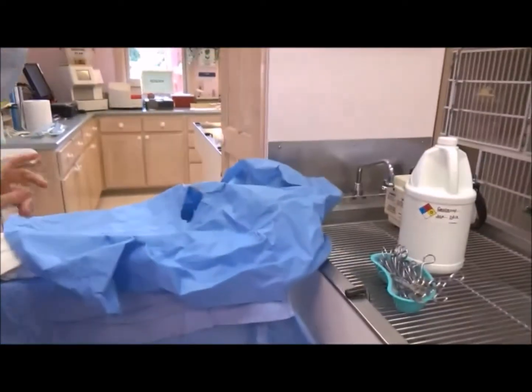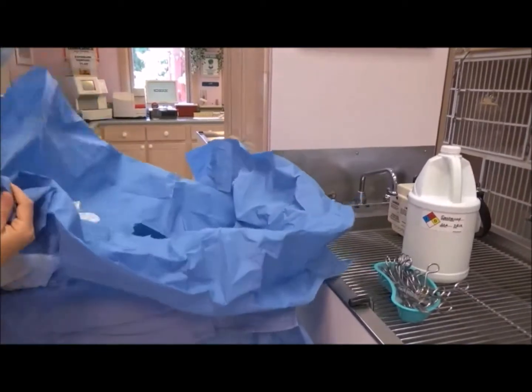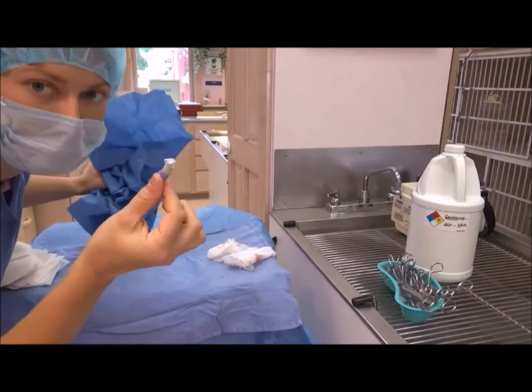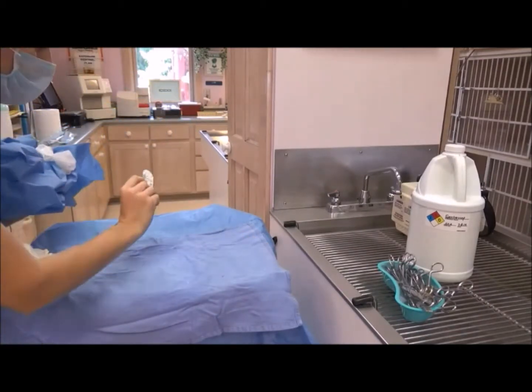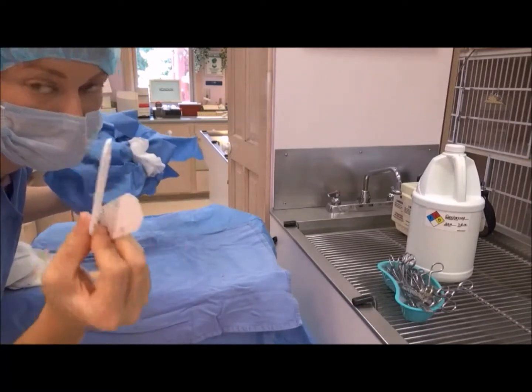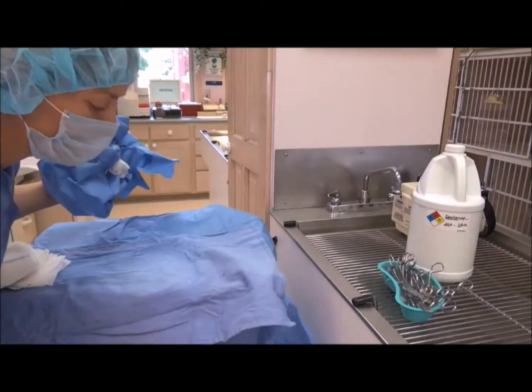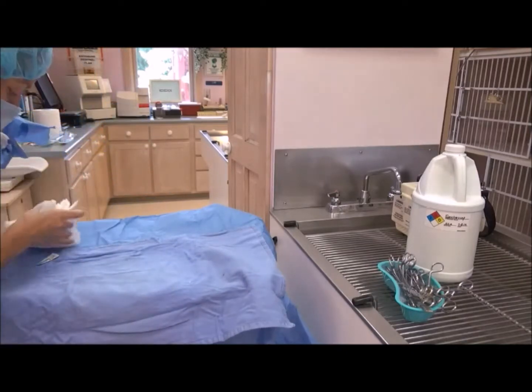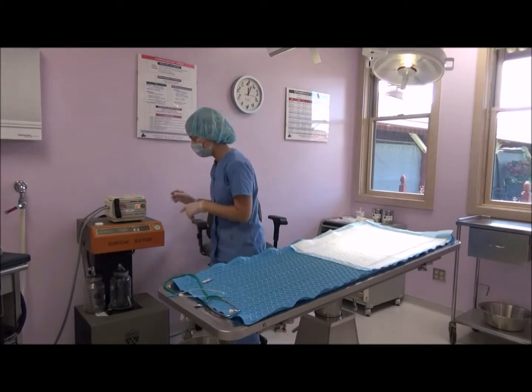Back to the pack here. For our drapes, we also use a disposable drape, so I'll go ahead and dispose of this. And then we have some empty tissue mend glue, so I'll dispose of that as well. These here were from our suture materials. They're disposable, it's trash, we'll take care of that. And then obviously this blue drape here that was used inside the pack, I'm going to wash this. I can see there's a little bit of blood on that, so I'll be sure to take care of that as well. So now I'm good to turn off our water blanket here, our warming blanket.